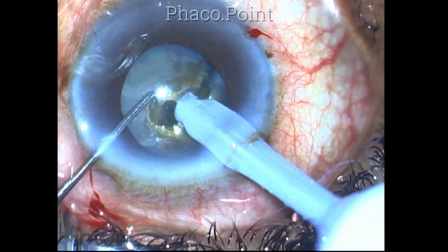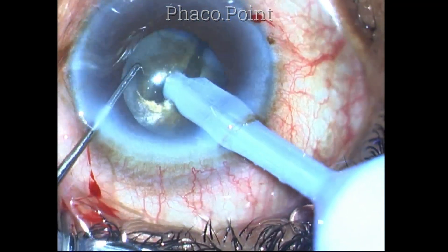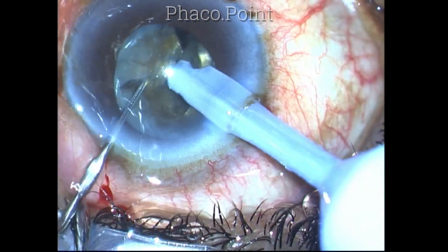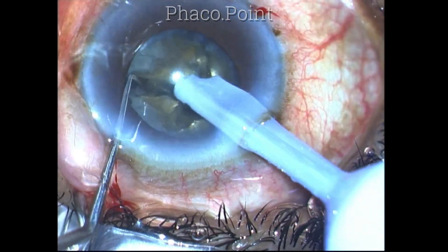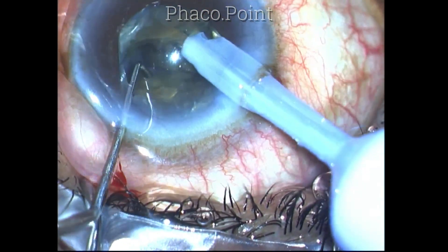Once I create the crack, I'm able to carry it down through and through throughout its entire extent. I also successfully managed to split the posterior plate of the lens.